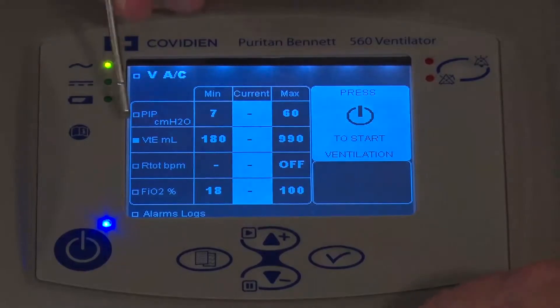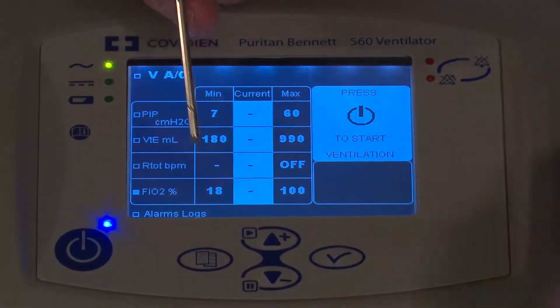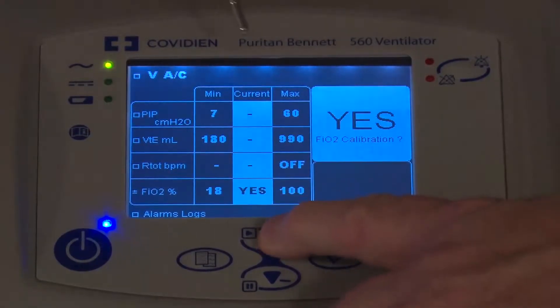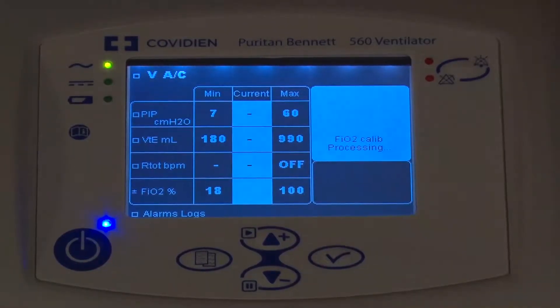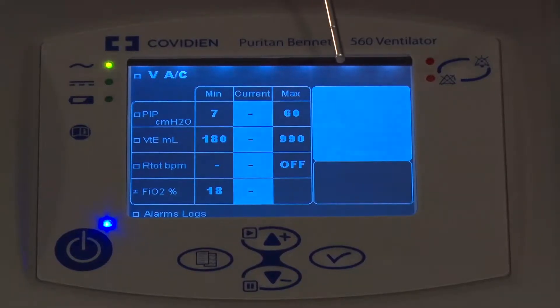I'm going to navigate down from the tidal volume with the arrow keys down to the FiO2, press the Enter key twice. It's in the off position; I'll use the arrow up. I do want to do a calibration — yes. I'll press the check mark to confirm I want to do the calibration. This is a very quick test, and it's already completed.